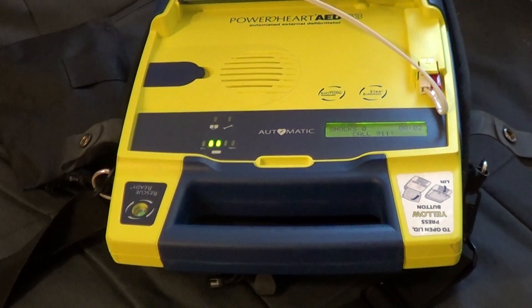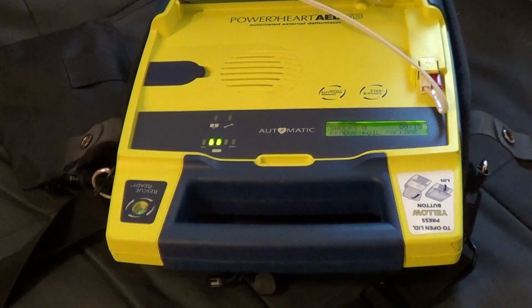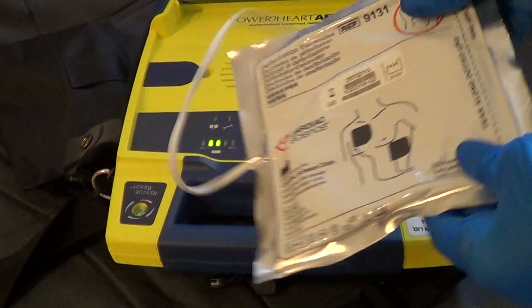Stay calm, follow these voice instructions. Make sure 911 is called now. Begin by exposing the patient's bare chest and torso. Remove or cut clothing if needed. When the patient's chest and torso are exposed, remove the square foil package from the lid of the AED.